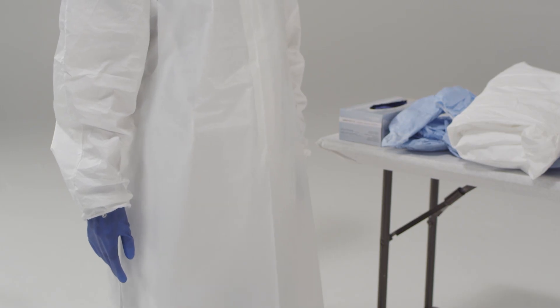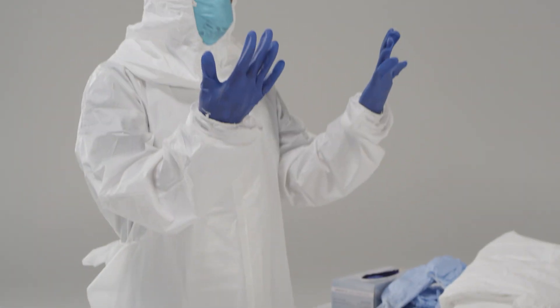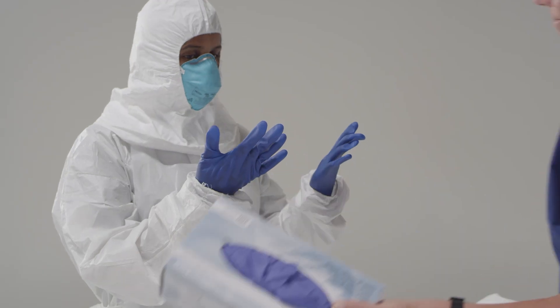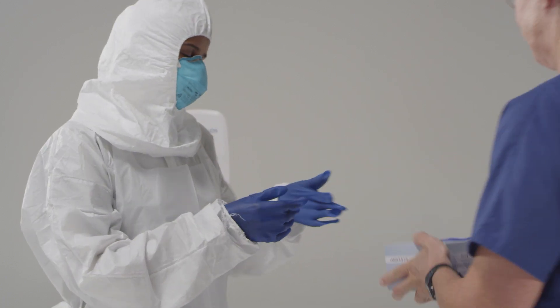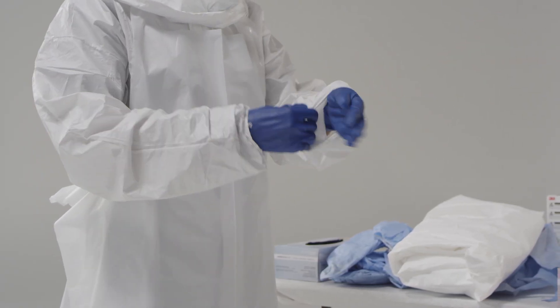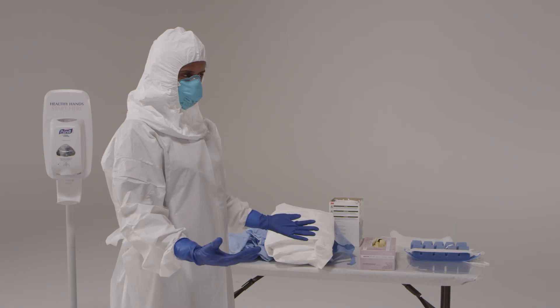Other examples of proactive risk monitoring during donning might include identifying issues with equipment: 'I'm looking at your gloves. Do they seem to fit? They look a little big. Let's get you a different size.' Identifying placement and fit issues with personal protective equipment: 'Now we're going to verify that the PPE was placed properly. We're going to make sure that all your skin is covered.' Controlling the pace of the donning process: 'We're going to do this safely. We're going to do everything slowly and methodically. I'm here to help you if you have any questions.'